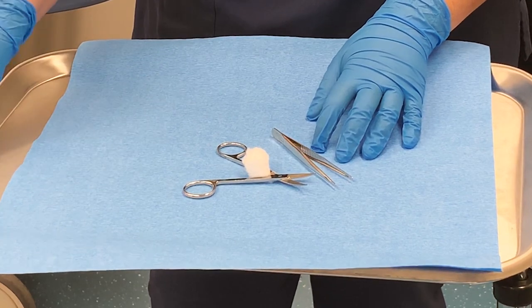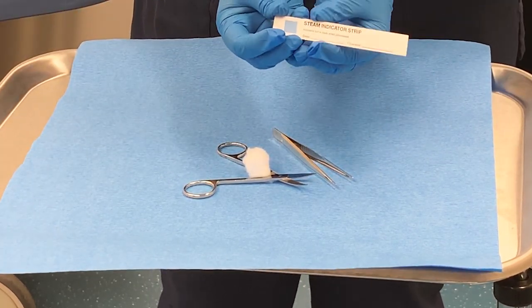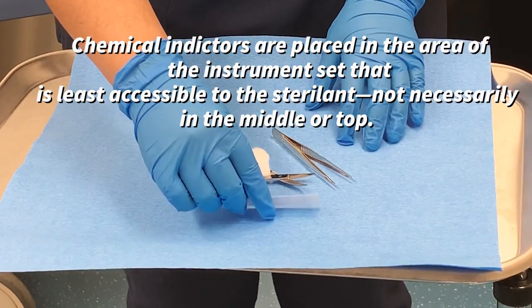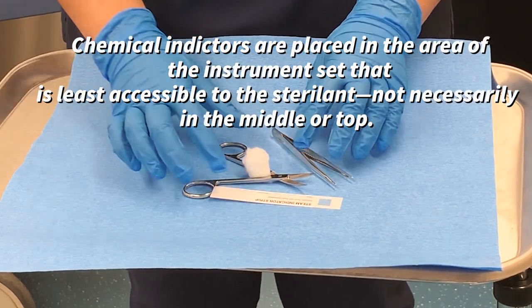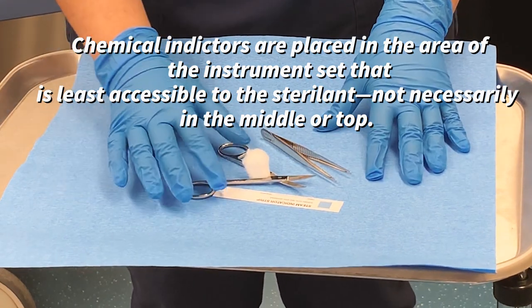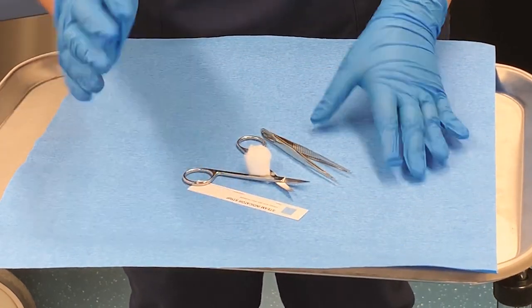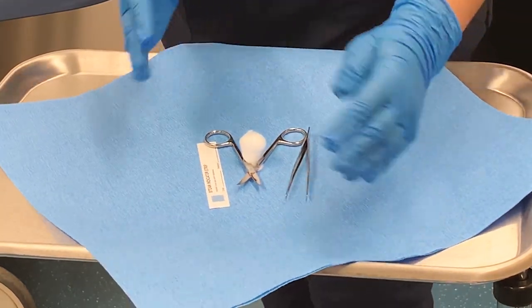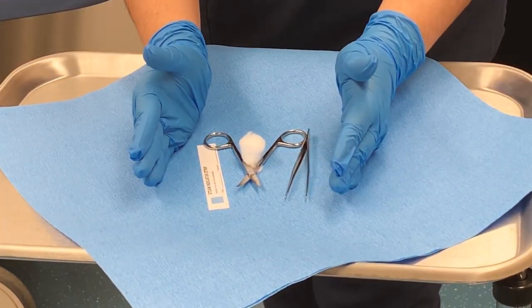Next, you're going to write the date and the operator's name on the indicator strip, and you're going to place it in with your instruments. And you're going to place your instruments in the center of the diamond — if you were to turn your paper like this into a diamond, it's right square in the center.